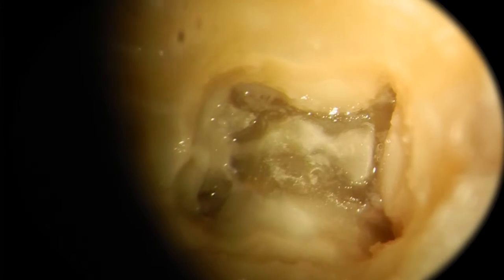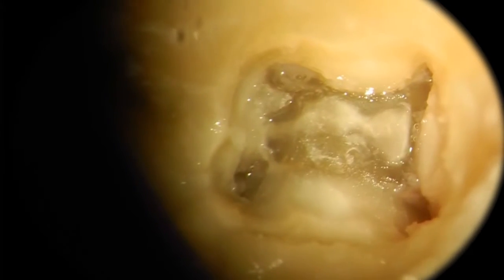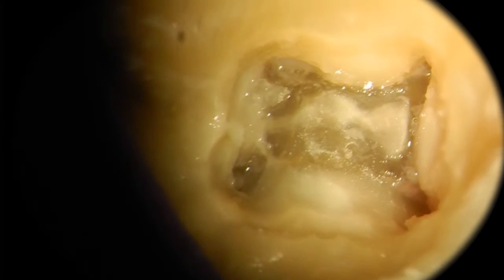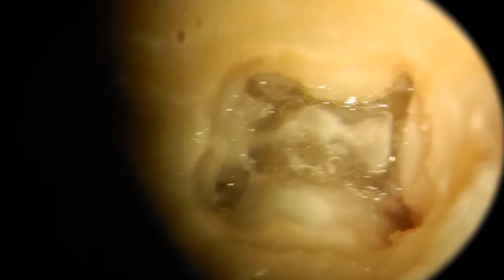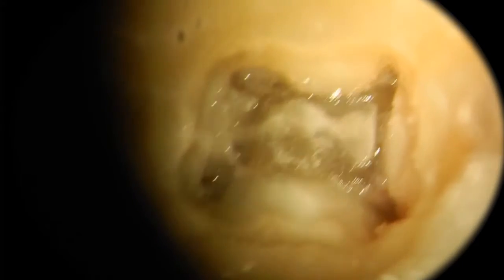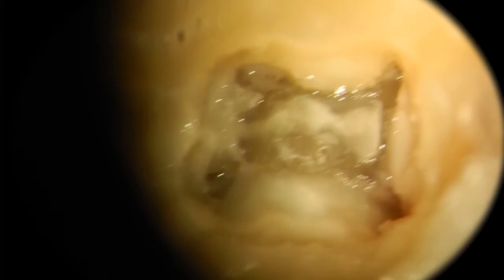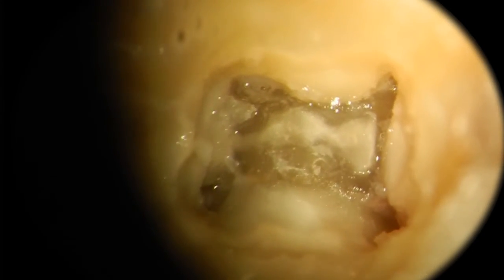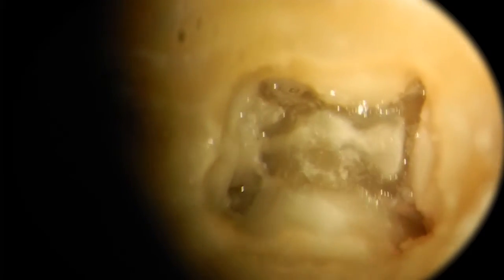And again, I just want to reiterate that if you're going to be doing a lot of endodontics, a microscope makes things unbelievably more visible. It takes the stress and strain away from your days. It does take some practice. And again, so does having a very good patient like we have here in the chair. So there you go, guys. Think about a microscope.